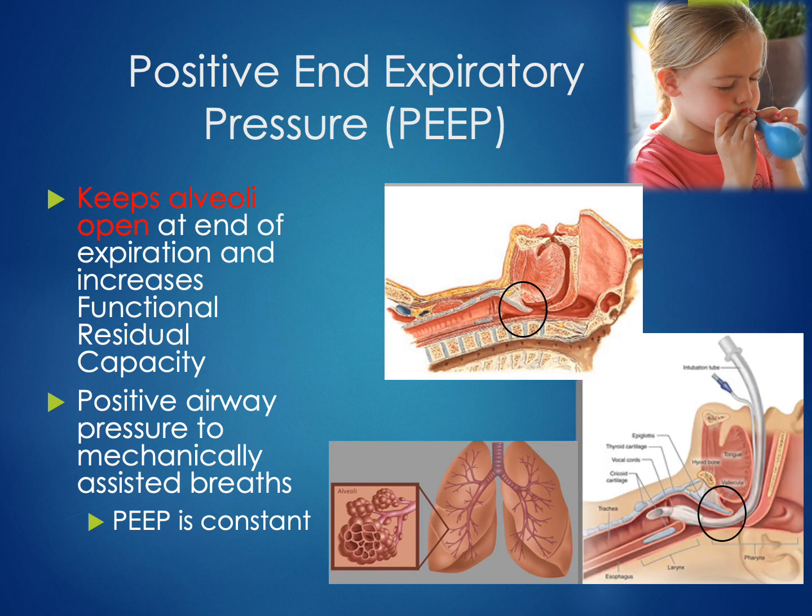Now, once we put our patients on a mechanical ventilator and put this artificial airway in, that disturbs how the epiglottis normally works, and we have to create this same phenomenon of residual volume artificially with this machine. We have to create some constant pressure to keep our lungs always a little bit inflated, just like that balloon, and that way all of the breaths delivered will work better.